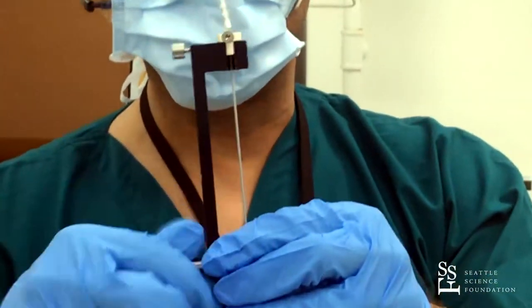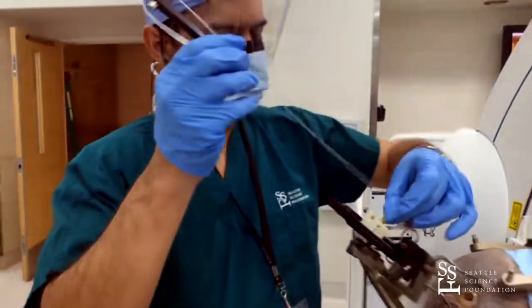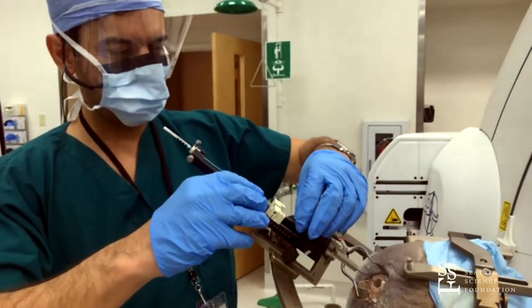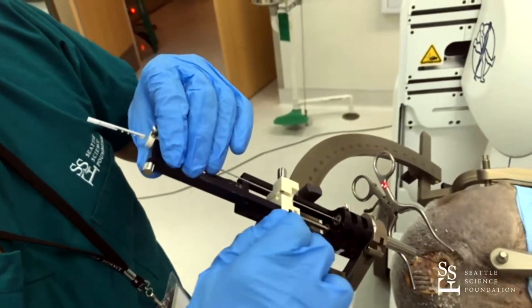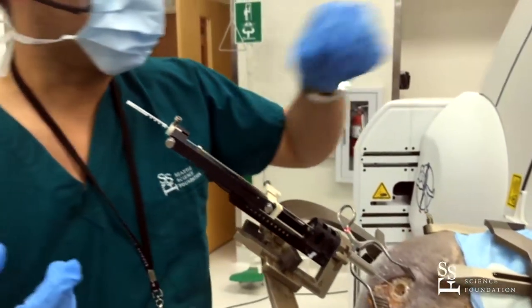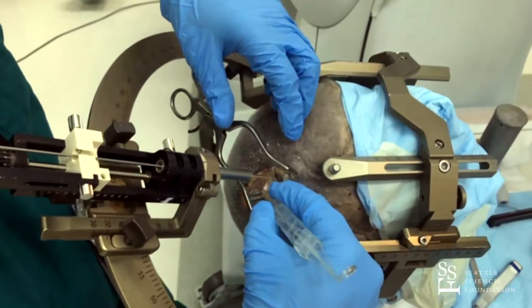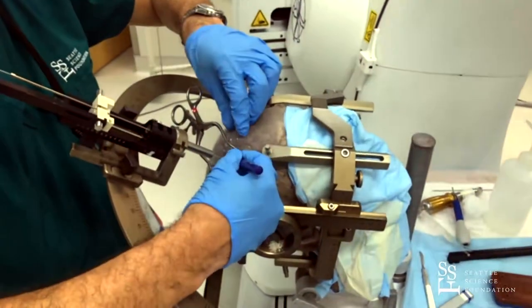This little stick is basically made to measure the DBS lead so that when we position it on the star drive system, it will end up right at the target. We advance it further. Now the DBS lead is in place — it should be right at target. I place it such that the second contact up is the one that's going to be at my target, so I've got a contact below and above. Then we use this little Pacman clip to secure the lead without shorting it — if we pinch too tight it'll short circuit the lead. We lock that in place and mark it so we know it's not moving.